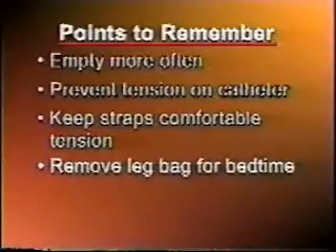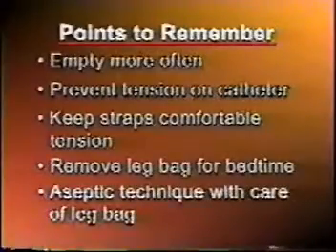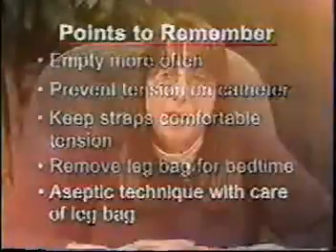Leg bags are only used when patients are up. Remove them before returning to bed. Care must be taken not to introduce germs when opening the connections. Now I would like you to watch the demonstration of applying the leg bag.